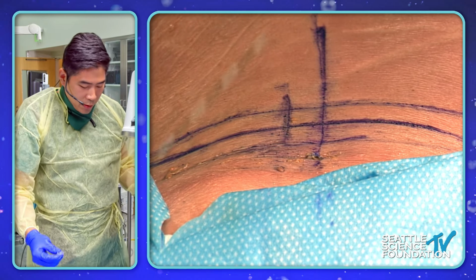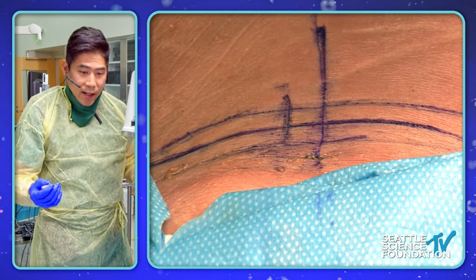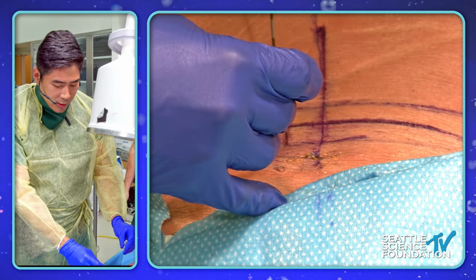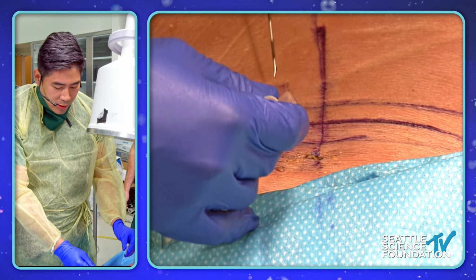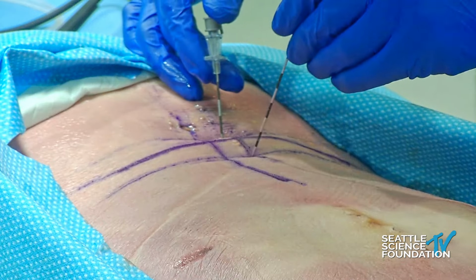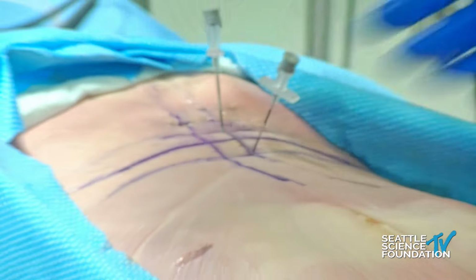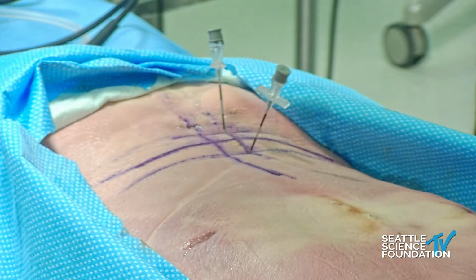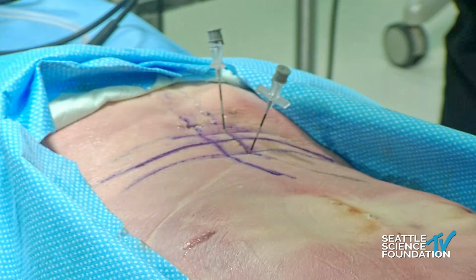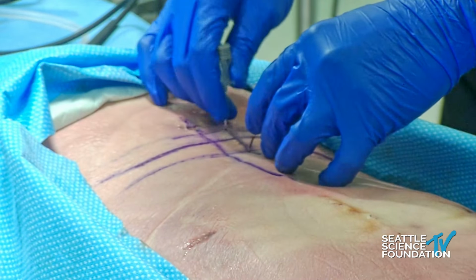So I'm standing on the patient's left side. I'm right-handed, so my left hand is always going to be the scope. My right hand is going to be the tool. So here's the entry point for the bottom. It's going to be my tools, and then this will be my scope. Now, after I go in and take a shot here, okay, the bottom hand is too cranial, so I'm going to adjust it. I'm going to go down more straight up and down.